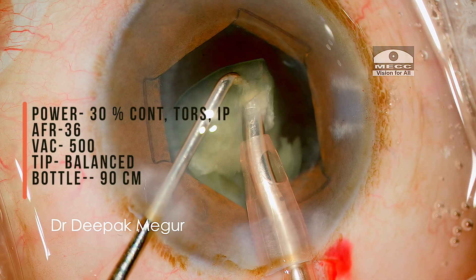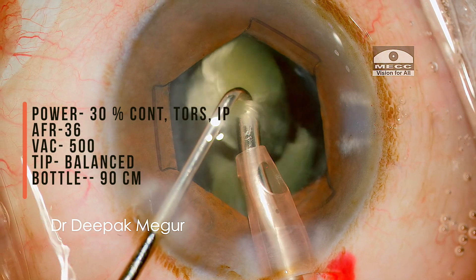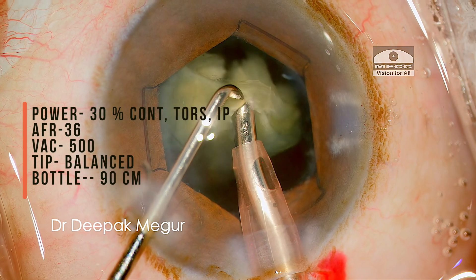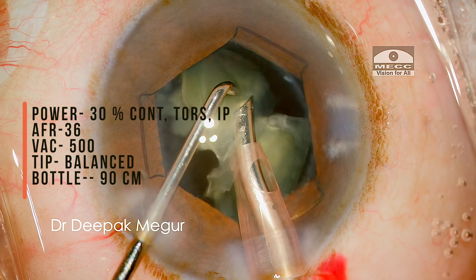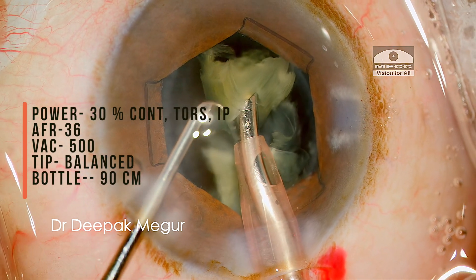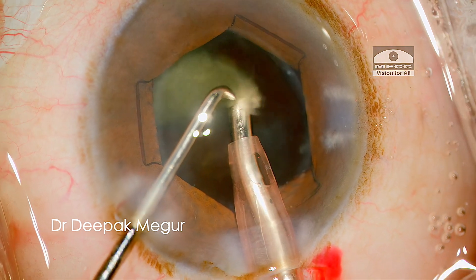The parameters have to be such that the fragment is held glued to the tip and must be dancing around the tip until finally getting emulsified. To minimize the chance of repulsion, the phaco power must be efficiently controlled using the foot pedal.